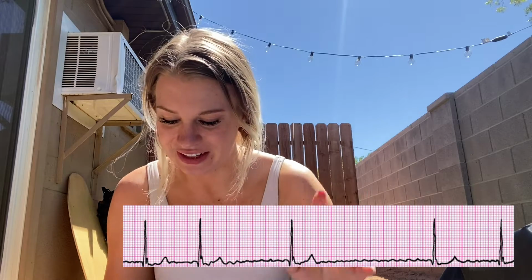And you always cardiovert on the R, and it's going to be a nice planned procedure rather than in a code situation where you're like, let's get this patient shocked. They're going to plan it out, it's going to be scheduled, they're going to come in, you're going to shock them, all that good stuff.